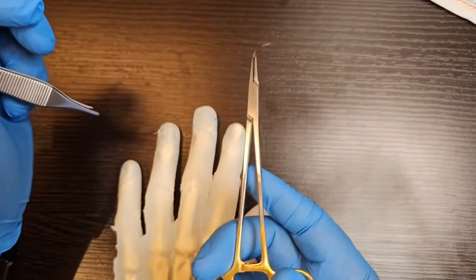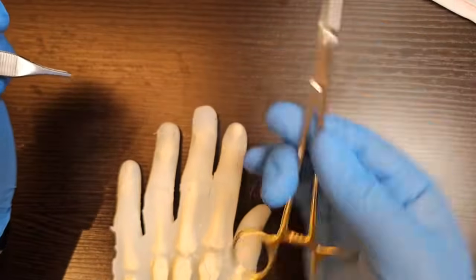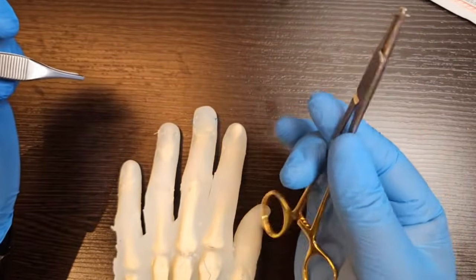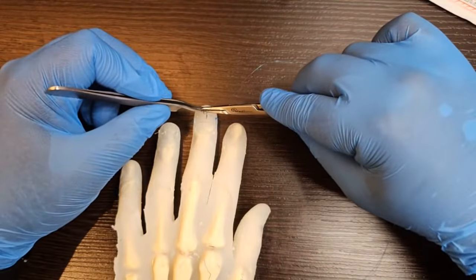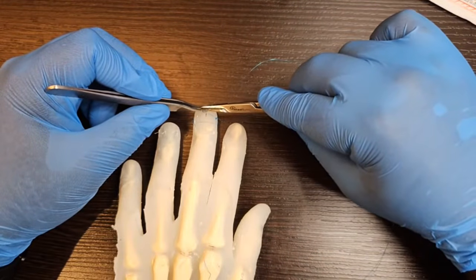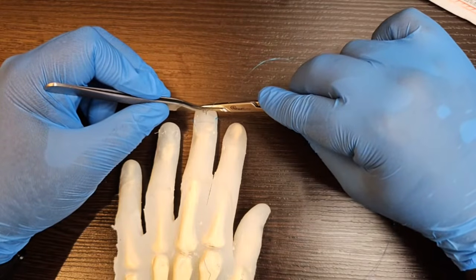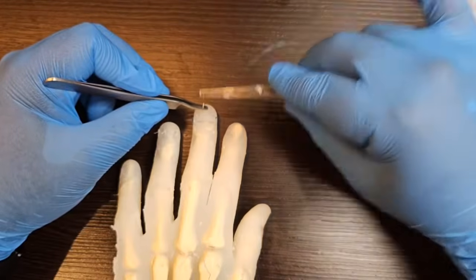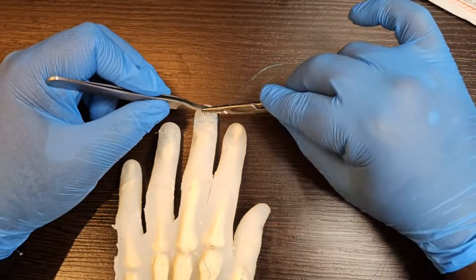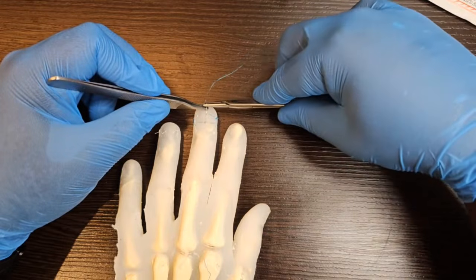So I'm like this, take my fingers out, and then I am just literally rotating the needle holder in my fingers. So doing nailbed repairs, this is a sterile matrix, saying that the nailbed is very thin. As soon as you go in, you usually hit the bone. So I palm the needle holder so I can just pivot it in my fingers. As soon as I touch it, I rotate. You don't want to force it, you want to follow the curve.